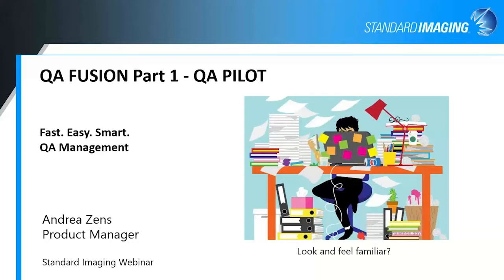I'm going to be talking about QA Fusion, the whole idea of QA Fusion, and focusing on part one of that, which will be talking about QA Pilot, a very fast, easy, and smart way to manage your QA.